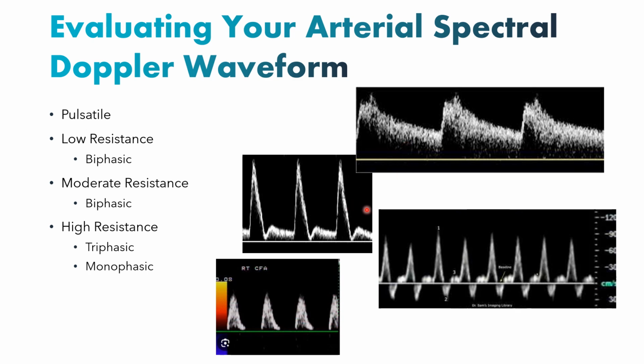So this could indicate a little bit of stenosis up ahead if it was feeding a very low resistance tissue bed, or it could mean that it's feeding a tissue bed that has a little bit higher resistance, maybe a muscle at rest or something like that.